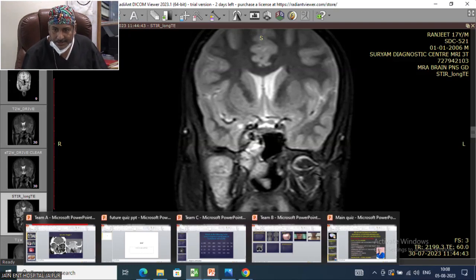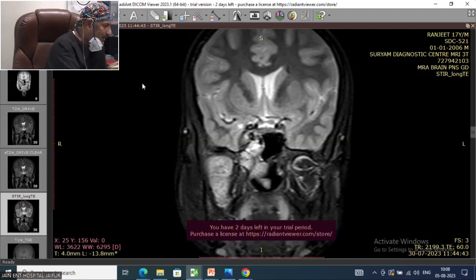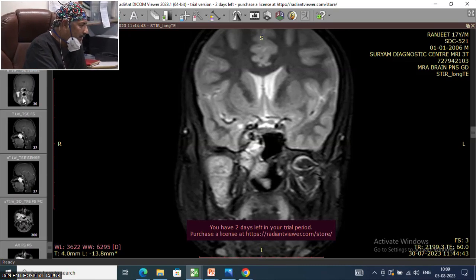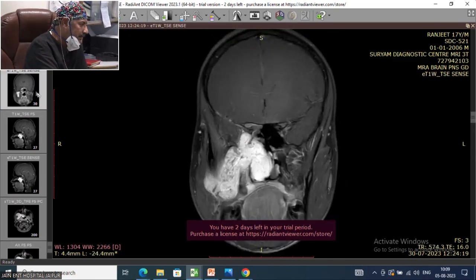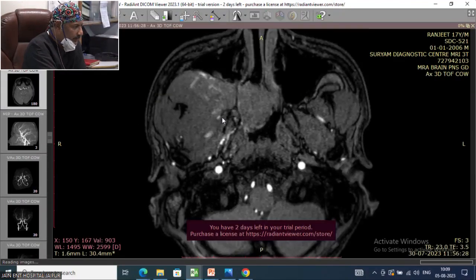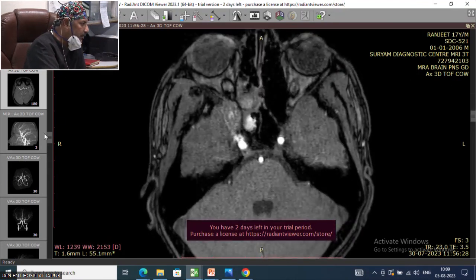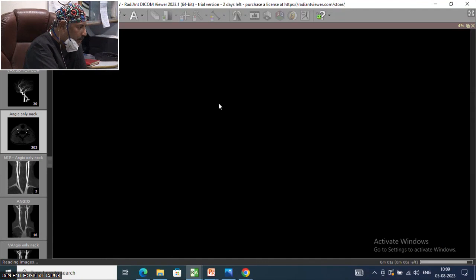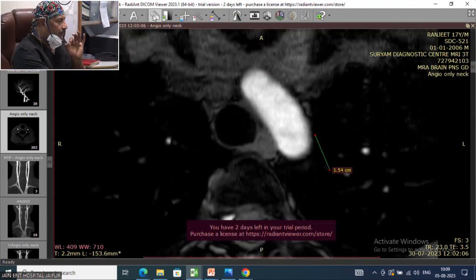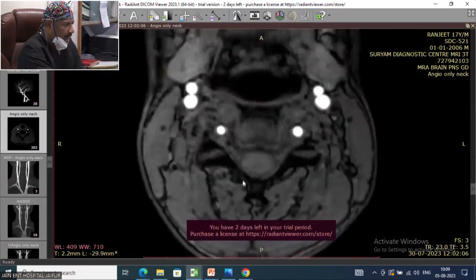We generally don't go for pre-op embolization. Generally we don't, you're right. We sometimes get the embolization done. It depends upon the feeders which are going to the tumor. Let me tell you, once you have asked the question in a proper way, how to look at the angiogram to find the need for embolization. See this, I'm just showing you how to look at the angiogram.